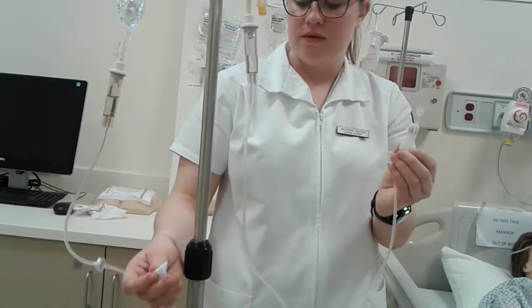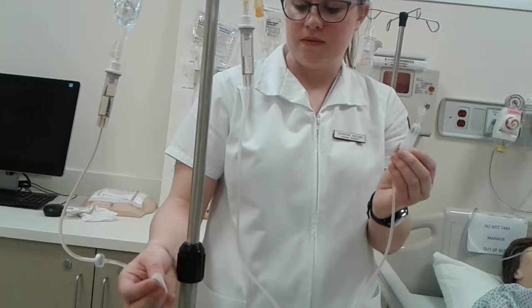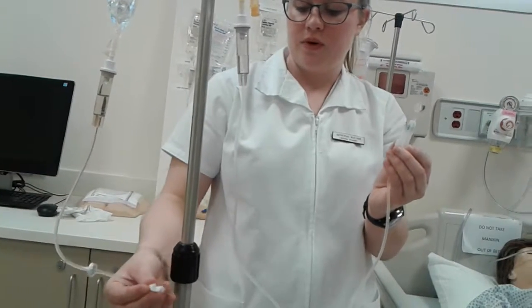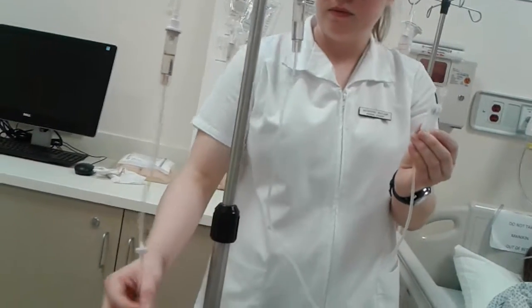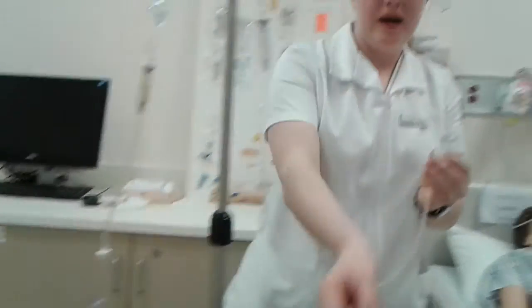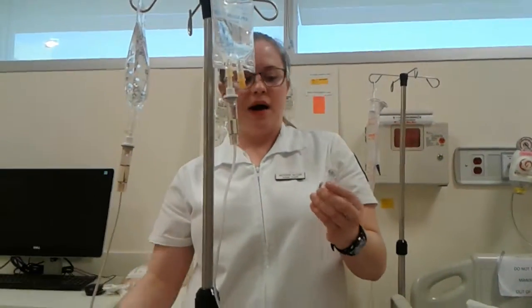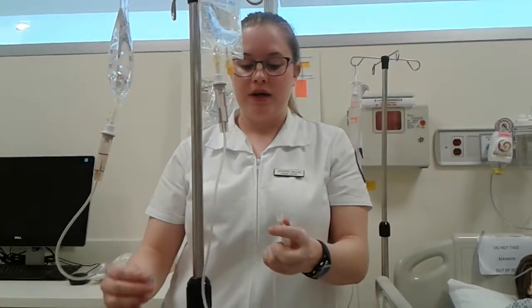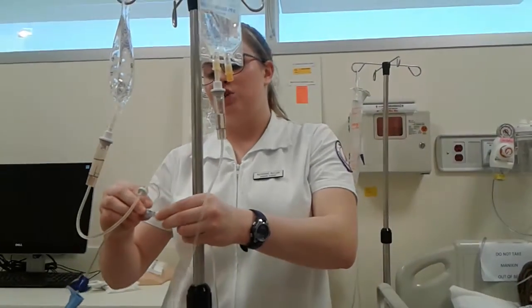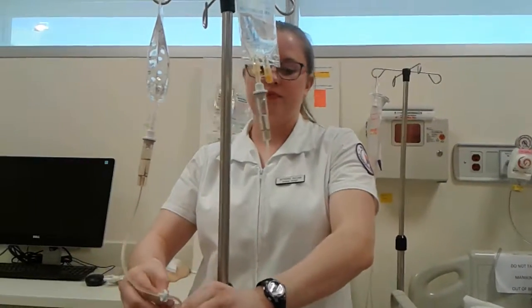I'm ready to clean the patient's central line first. So I'm going to grab this out of the sterile field. I'm going to break it, and I'm going to come over and clean the site. So now that my IV tubing has been sterilized with the alcohol swab, I have my IV piggyback tubing completely clamped. So I'm going to insert the IV tubing into the primary tubing.